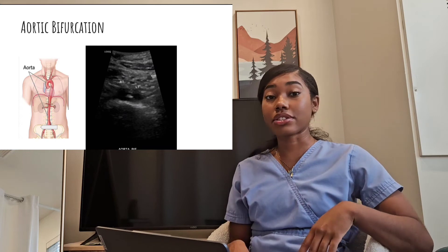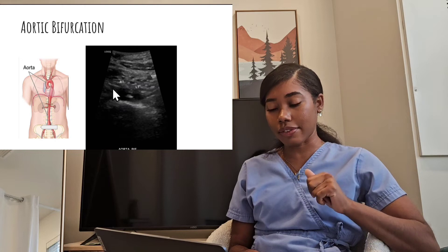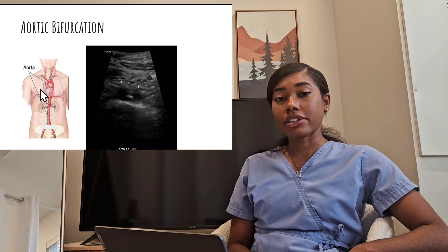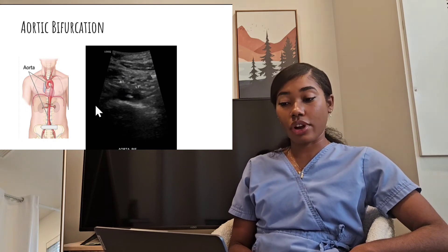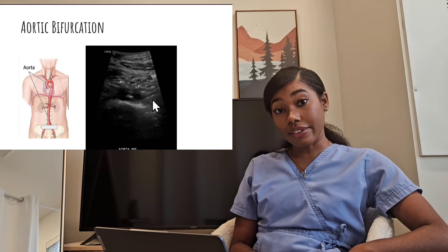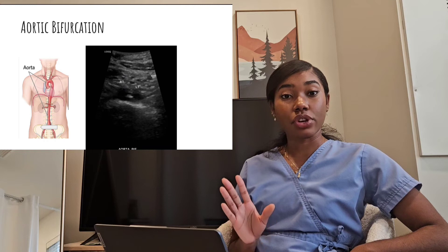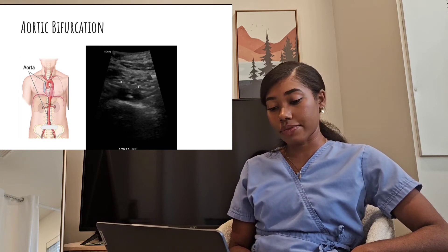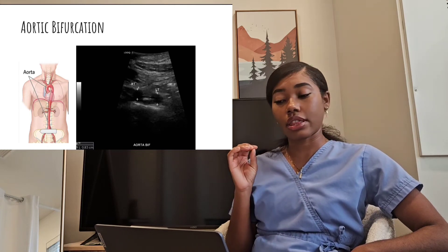Listen closely: the vessel on the left side of the screen is not the left common iliac artery — it's the right common iliac artery. The right side of the patient appears on the left side of the screen, and the left side of the patient appears on the right side of the screen. When I have my transverse image, I usually label which one is which — right and left — then measure the vessels in that same area.